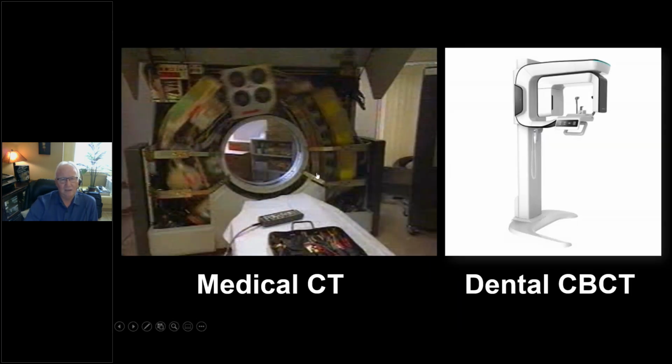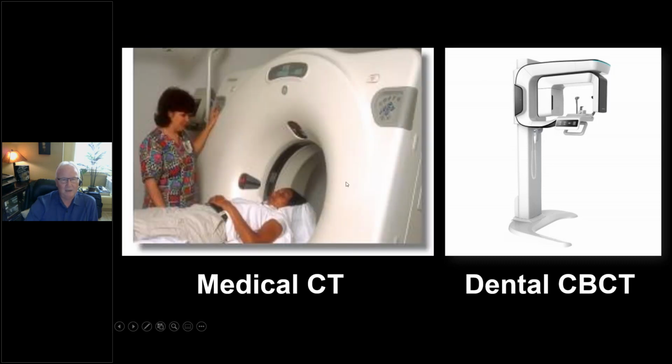So with medical CT, there's a couple differences. A big scanner, high dose, okay? But this modality captures every point of every piece of tissue in the scan that's acquired. Dental CBCT, like the one pictured here from Vatech, will capture cubes, not every point in the scan, but cubic areas in the voxels. So they can be very, very small, and the detail will be good, but they can't separate things like connective tissue, like fat and muscle, the way you can on conventional CT or then MR.